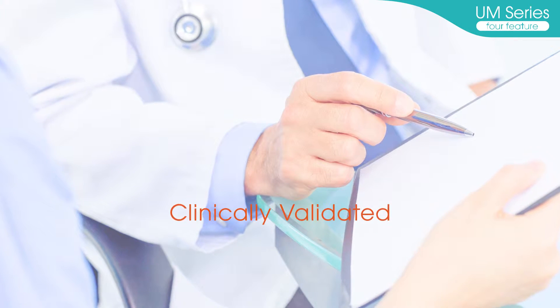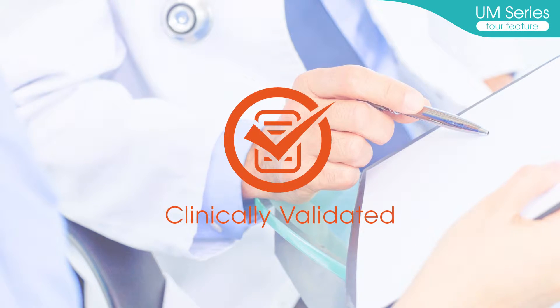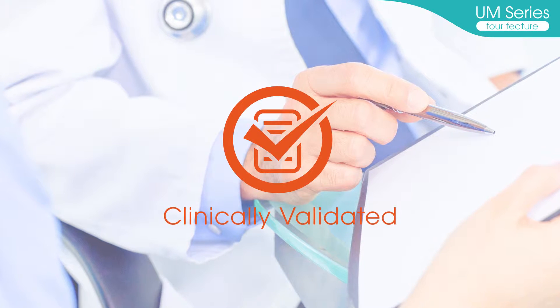Clinically validated. The UM-Series has been clinically validated, ensuring reliable measurement accuracy in medical settings.